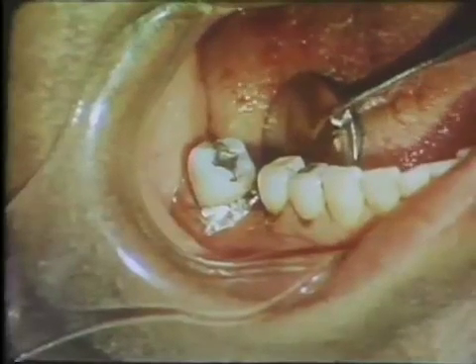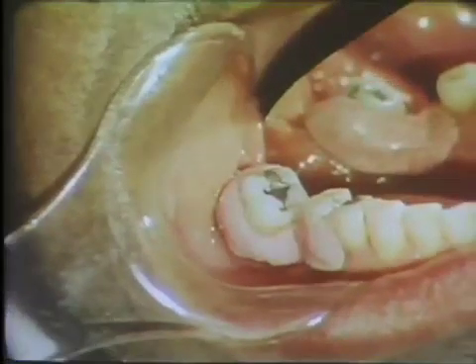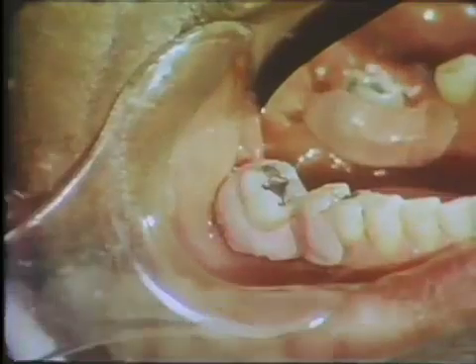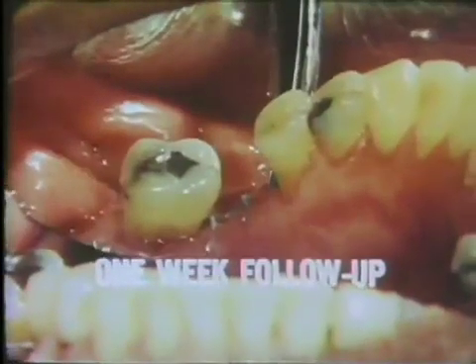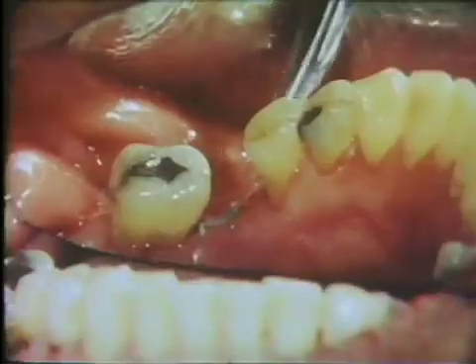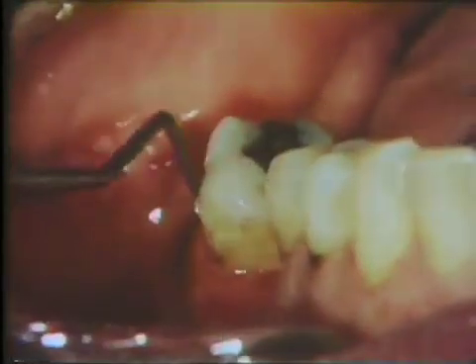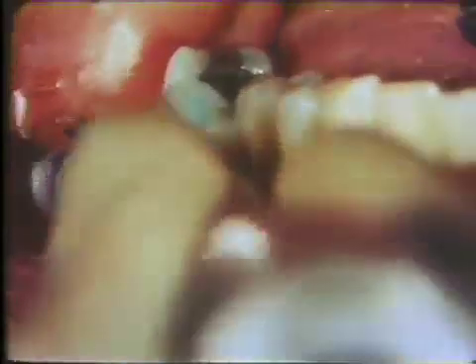Dry foil is placed over the wound and the sutures. Next, the entire area of surgery is covered with a protective periodontal surgical dressing. One week after surgery, the dressing is removed. At the dento-gingival junction, some evidence of residual inflammation is still present. The sutures are carefully removed at this time. The tooth is cleaned thoroughly with a curette and polished with a rubber cup and polishing paste. The patient is also instructed in proper home care.